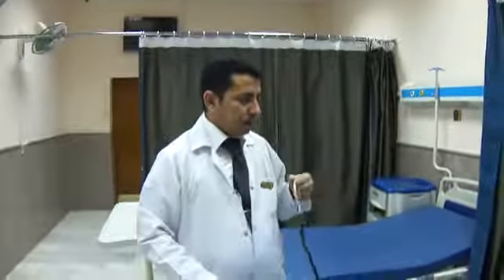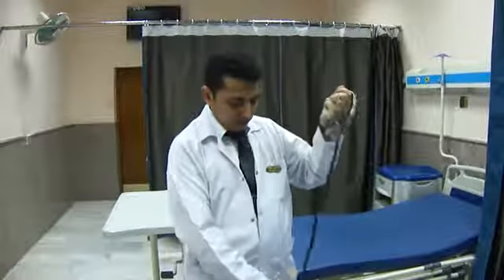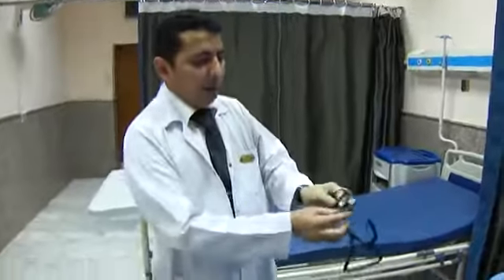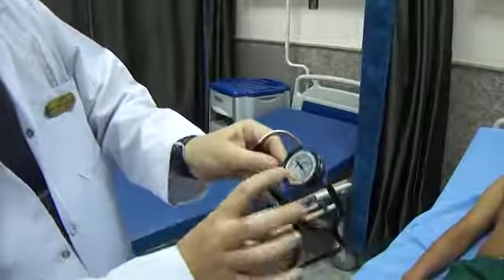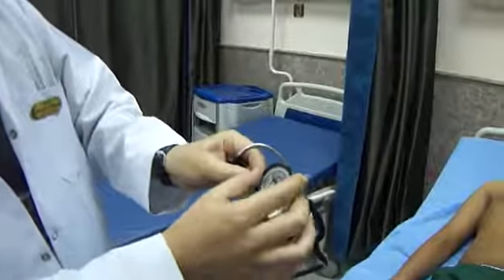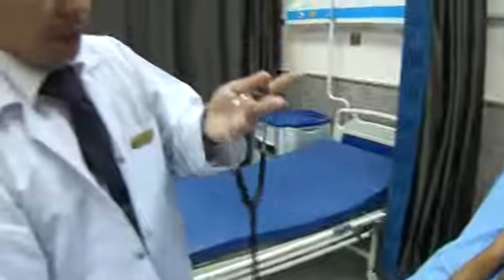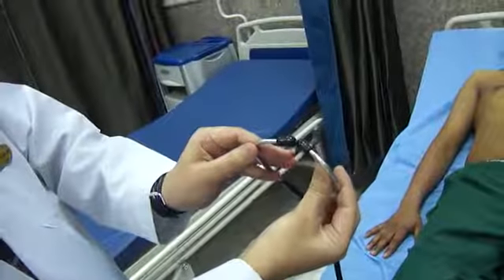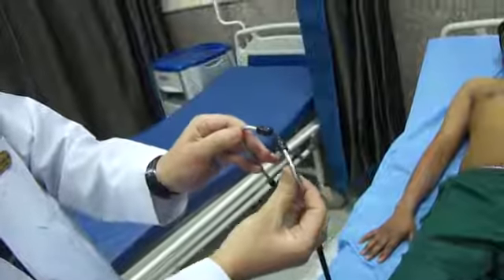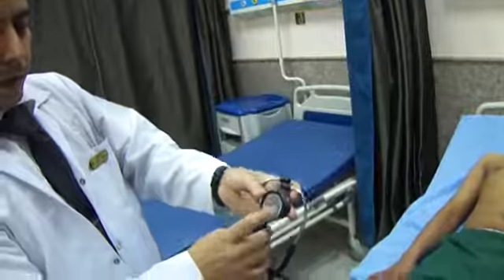Okay, the last step in the examination of the precordium, as I said, is the auscultation. We have to know the components of any stethoscope: the bell, the small distal part, the diaphragm, the larger part, and the ear pieces. The ear pieces should be directed anteriorly to fit properly with the external auditory meatus, and initially we have to listen through the diaphragm.